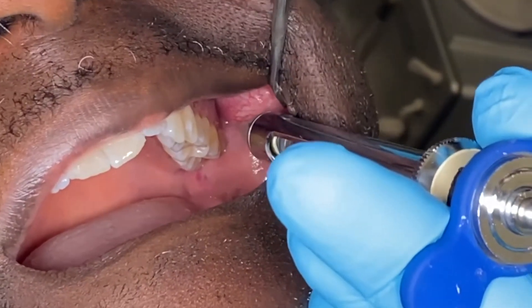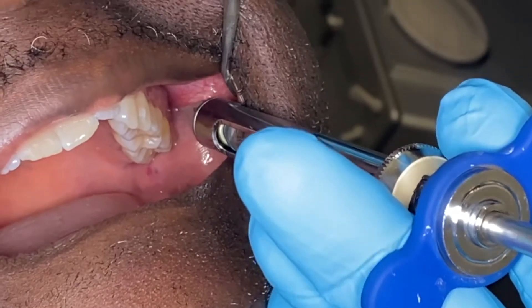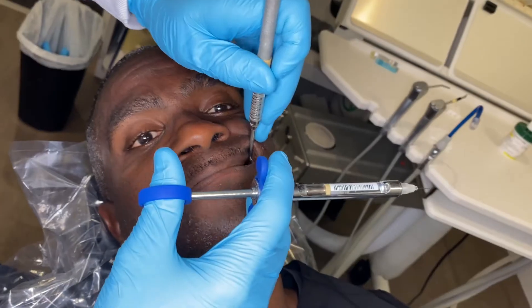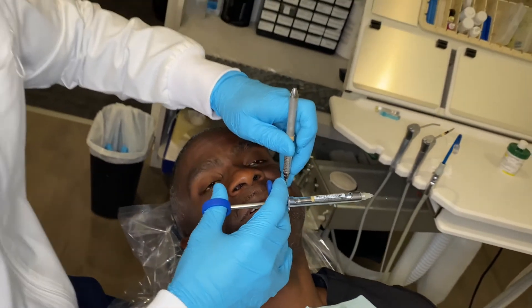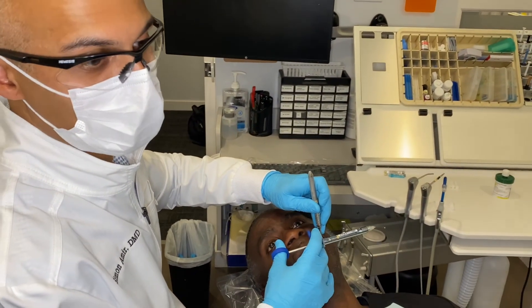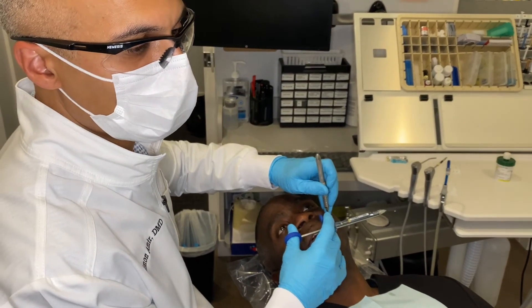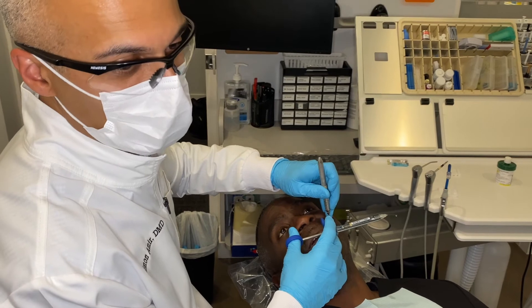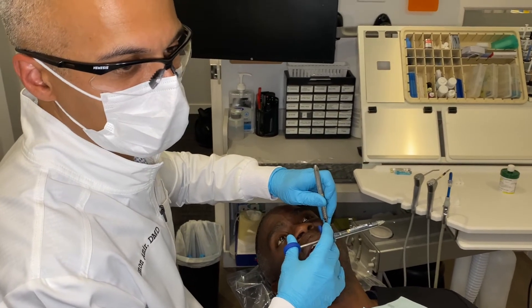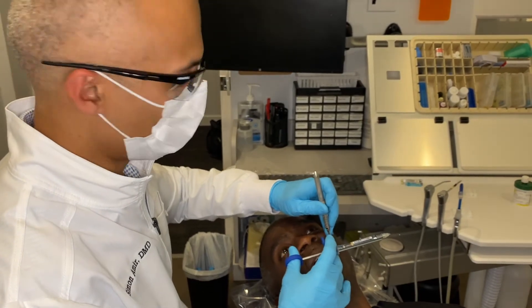A really good test to know whether teeth are actually numb is to use cold. We use a refrigerant spray, but you could use a piece of ice. If they can't feel the cold, the tooth is numb. You'll know with your patients really whether they're numb because they'll say, 'I'm out of pain now,' and that's obviously what you're going for.